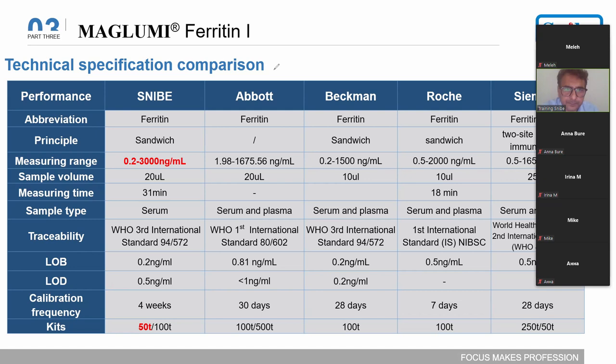Okay. I agree. You have big competition with Mindray, and they have some products with good features, but they are not good in precision. If you run the precision according to the CLSI guidelines, the instrument performance is not up to the mark. Yes, it's very important. So Artem Yurin, I will forward your inquiry related to the comparison.